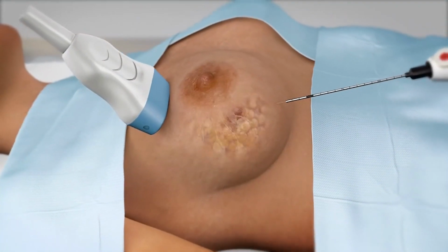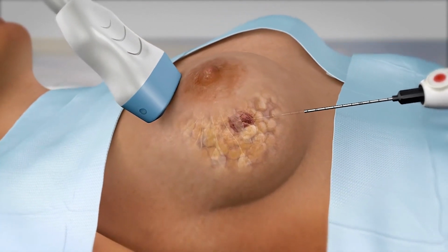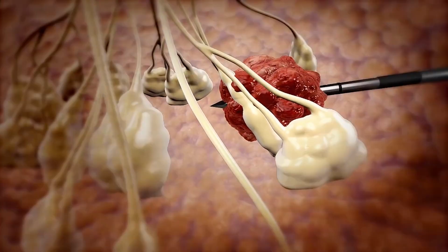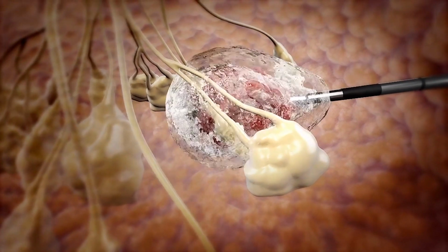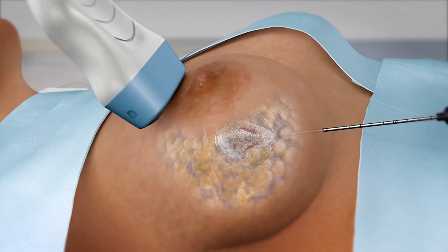In addition to positioning the cryoprobe in the center of the lesion, it's also important to position the length of the cryoprobe within the lesion so that the lesion is ideally positioned within the aperture that actually freezes, the segment of the cryoprobe that actually freezes. And fortunately, there's a formula that allows you to determine how far beyond the tumor the cryoprobe should be inserted so that you can properly position the lesion within the freezing segment, the uninsulated freezing segment of the cryoprobe.